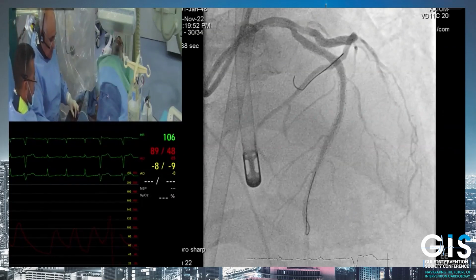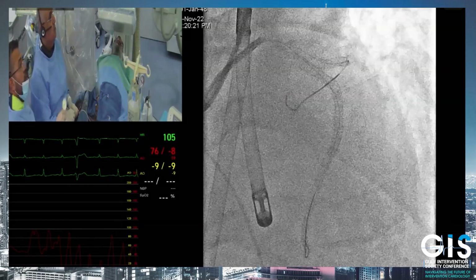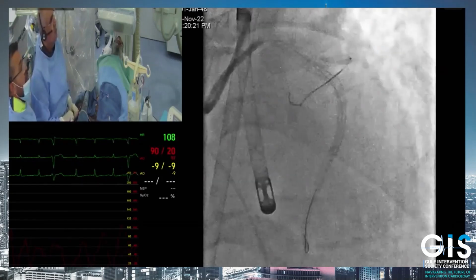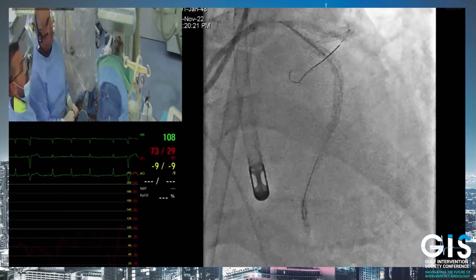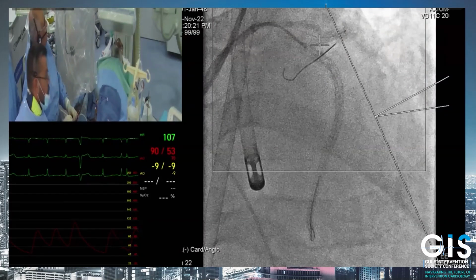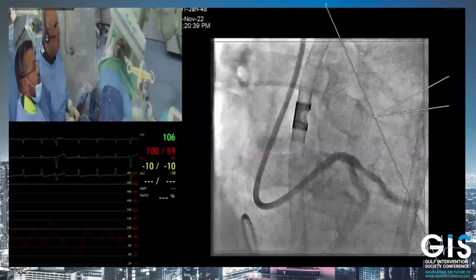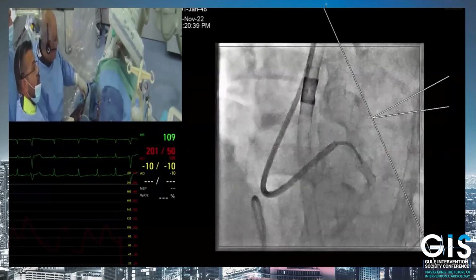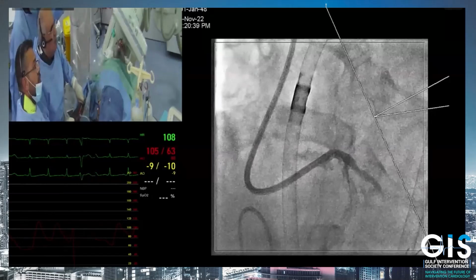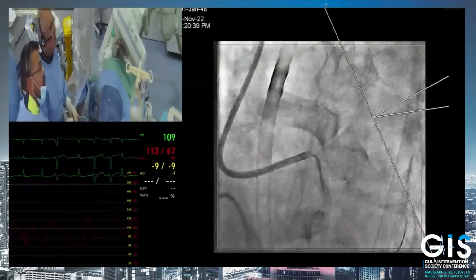And geographically, there's nothing. Opening the struts of a side branch when you do a left main LAD? Not systematically. If I decided to start with the provisional, I didn't touch the side branch before stent implantation. Sometimes, related to the findings, I can use functional assessment in case of need to evaluate the need for dilatation of the side branch, and the struts across the side branch, but not systematically. I always finish with the POT, but not necessarily with the side dilatation.